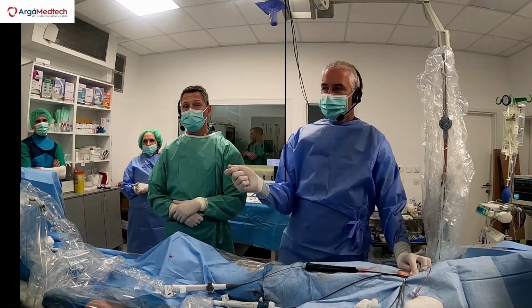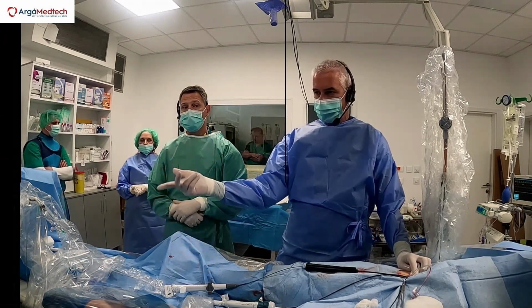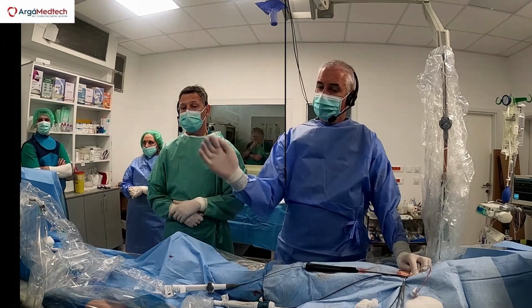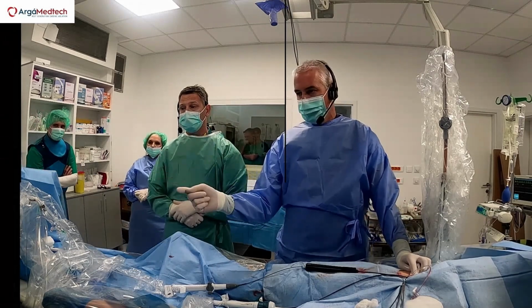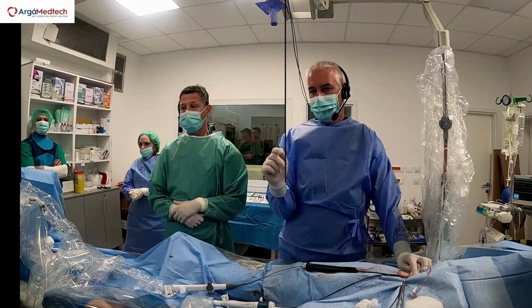Then we applied 4 standard, anchored in the left inferior to lateral part of the inferior line of the posterior wall. That's the same standard application as nominal dose for the PVI. And then we applied 1-2 standard. We might have applied 1-2 max, but we don't need focal max for the posterior wall. It's just 3 or 4 millimeters there. So we do 1-2 standard, a couple of focal applications.